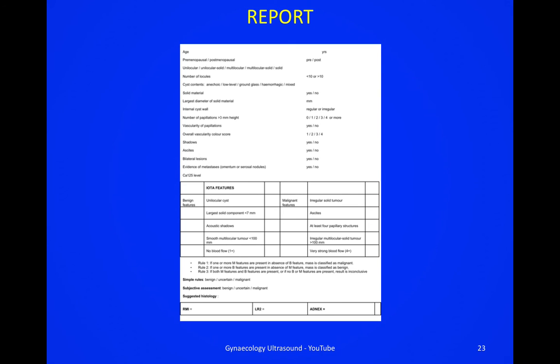This is the report that I use in my clinic. I find this extremely useful as it contains all the features that I need in order to report my findings.